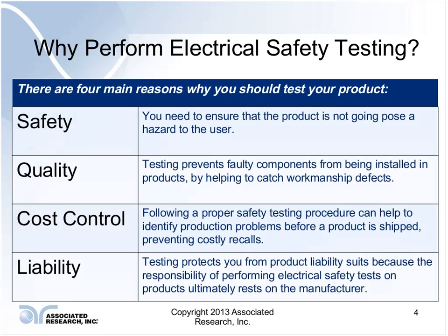This is just to make sure that the user is not going to run into a problem when they're using this device. Quality: testing prevents faulty components from being installed in products by helping us catch workmanship defects.